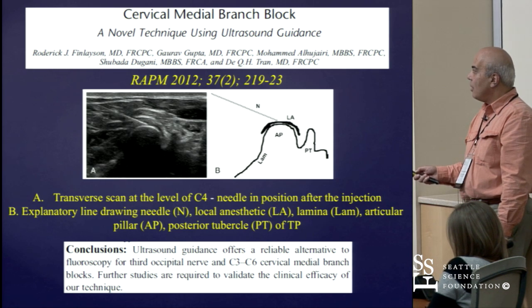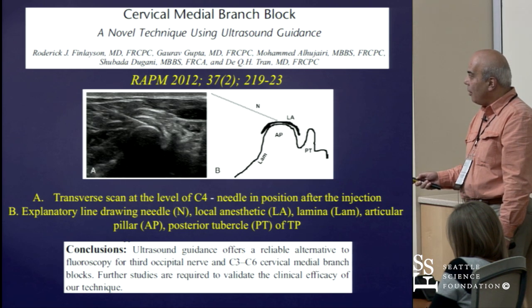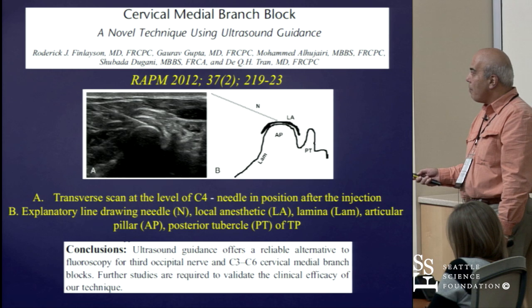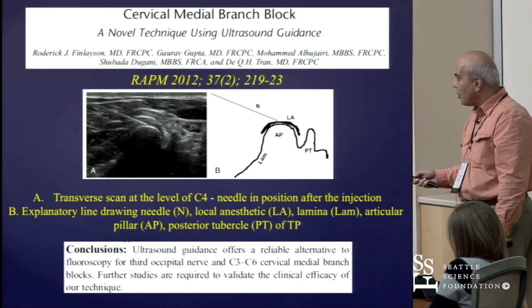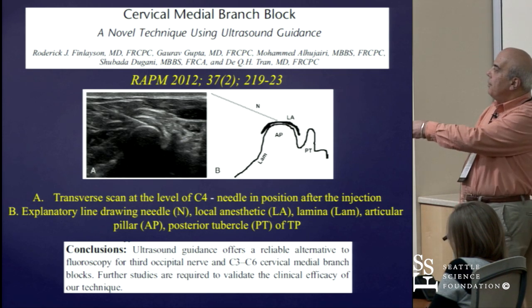You can see the local anesthetic right over here. You can see the lamina that is right around here, and the articular pillar, which is right over here, and the posterior tubercle of the transverse process that is somewhere around here.